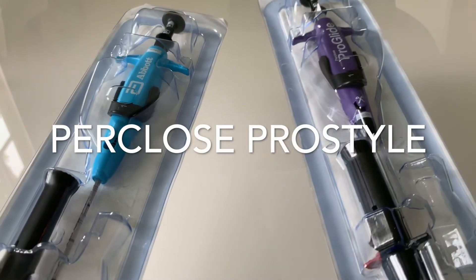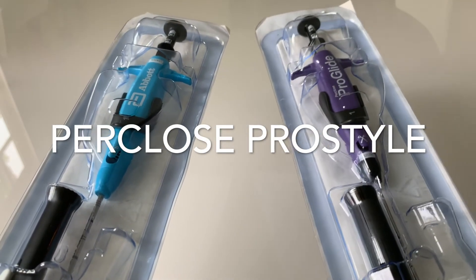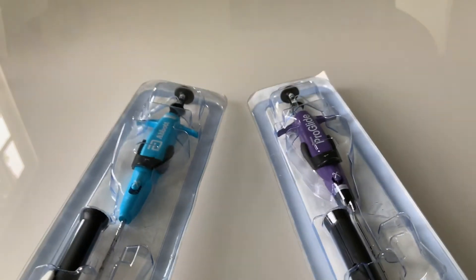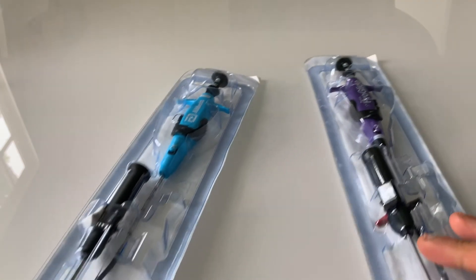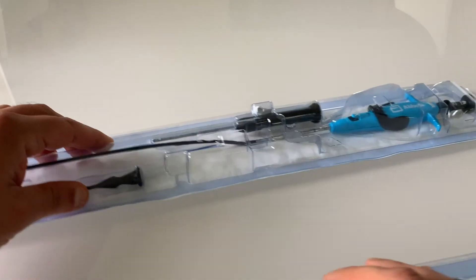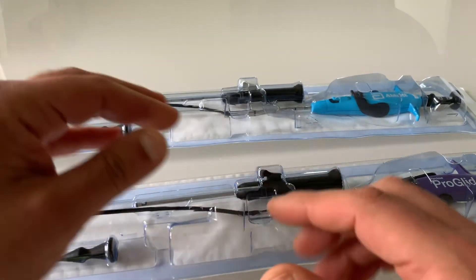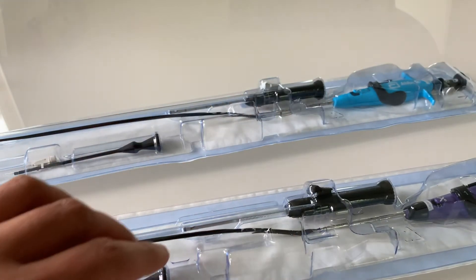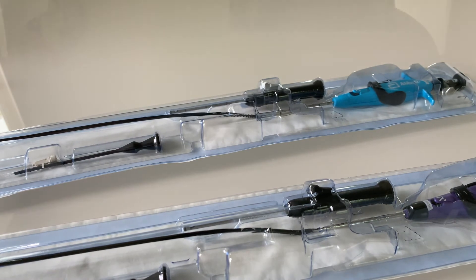Hi everyone, today we're going to compare the new Perclose ProStyle closure device to the original Perclose ProGlide catheter. I'm Rob Adderan from the Yale School of Medicine, and the first thing you should know is that if you know how to deploy a Perclose catheter, then you will be able to utilize the new ProStyle.